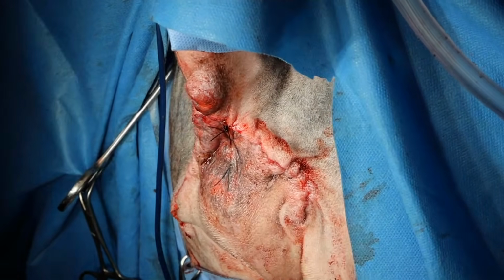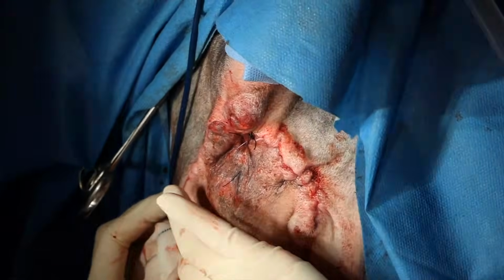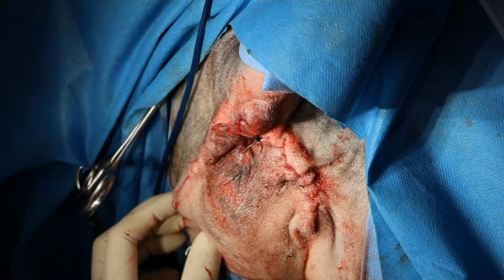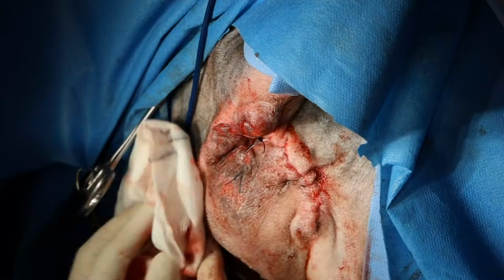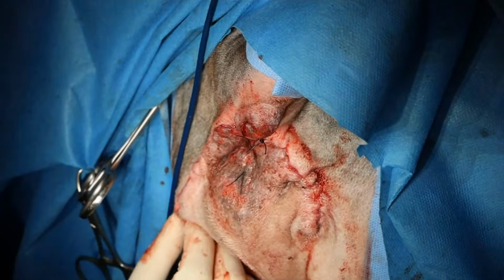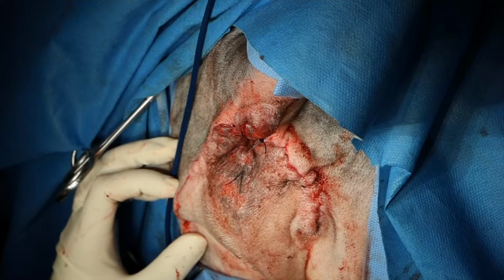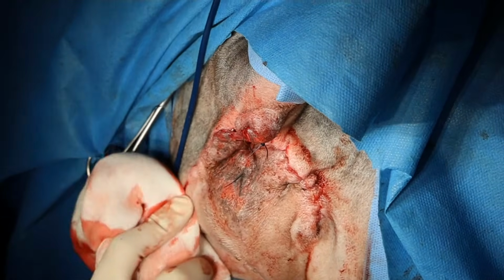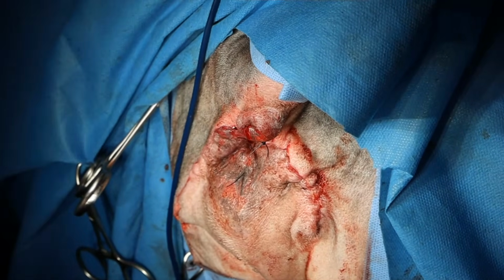That's great. And how do we ensure the transposed muscles maintain adequate vascularity? It shouldn't be an issue. Your blood supply from the internal obturator is going to be coming from cranially, so I don't think that devitalizing the internal obturator muscle is an issue at all. Do you think that's good here? Sure. You can put a few along there. All right, so that's pretty much it.